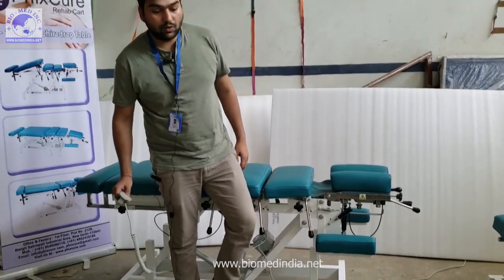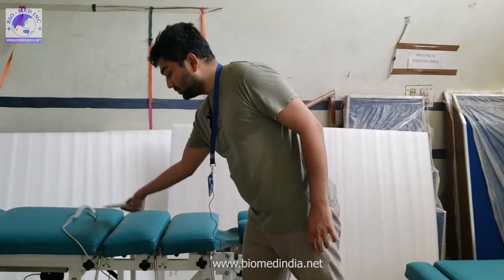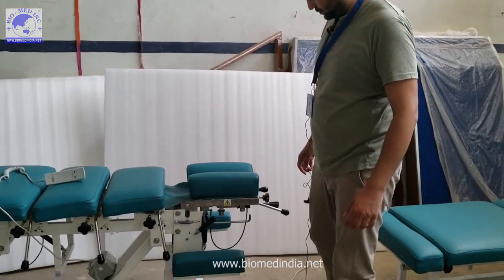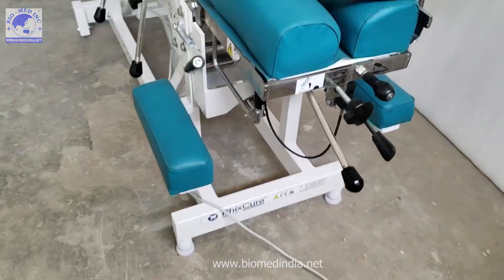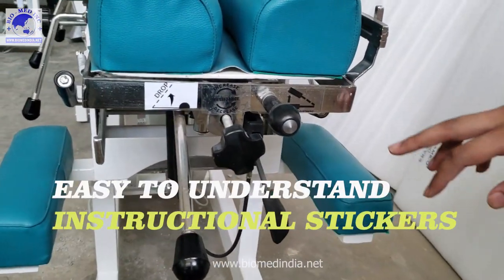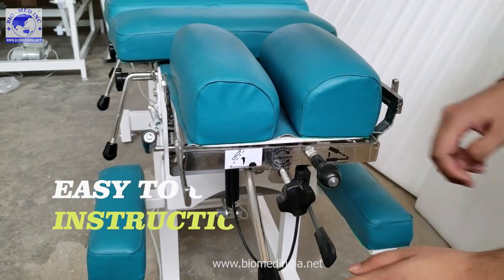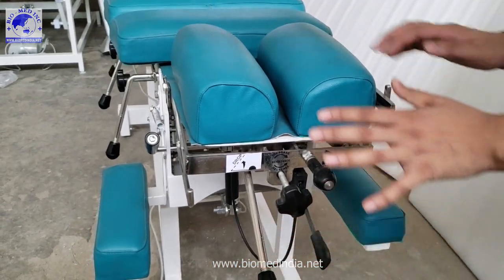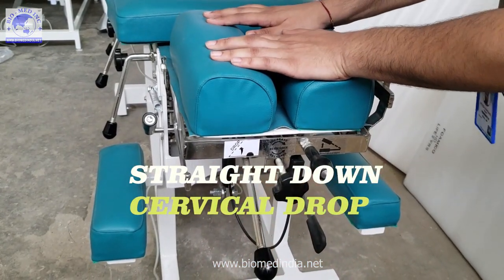The second feature is about the drops. The first one we'll start with is the cervical drop. For the ease of the therapist, we have included instruction stickers on the table. As per the sticker, this is the cervical drop — we are using a straight-down drop, which is the most durable and effective drop for the cervical region.